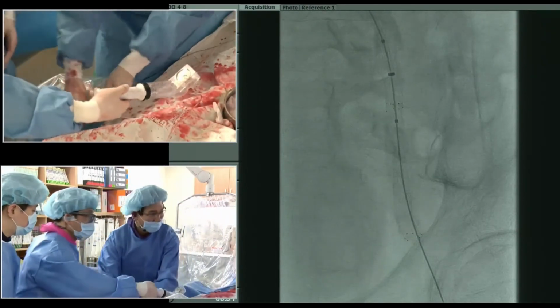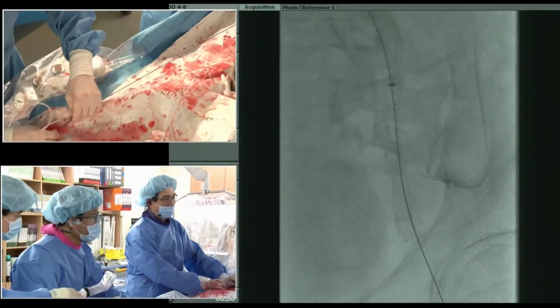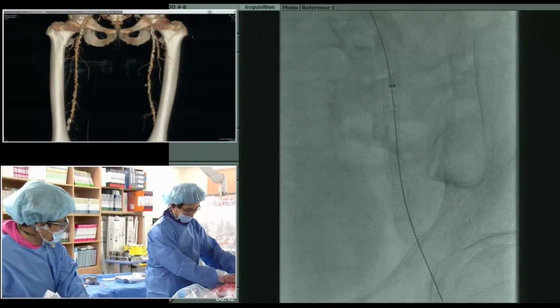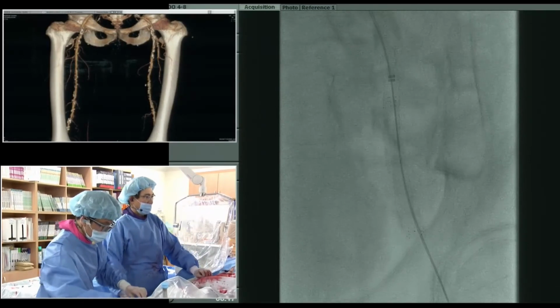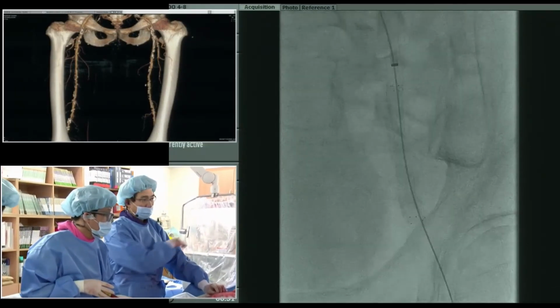Okay. Pull back the balloon. Pull back. Okay, thank you. I check down here. DSA. Okay, stop breathing.